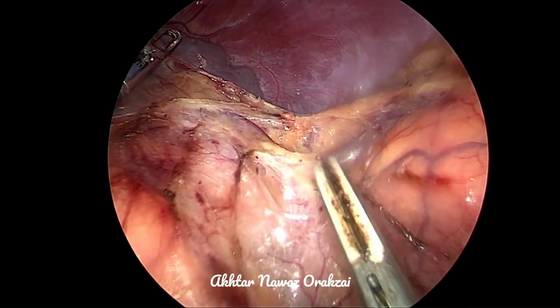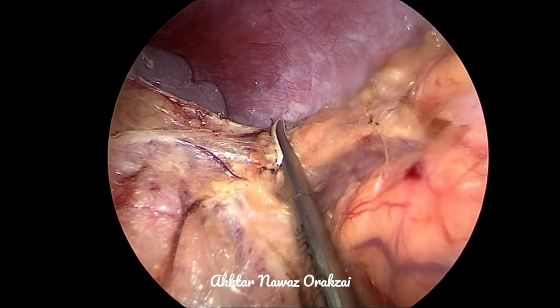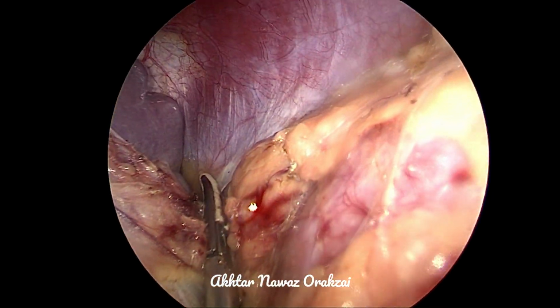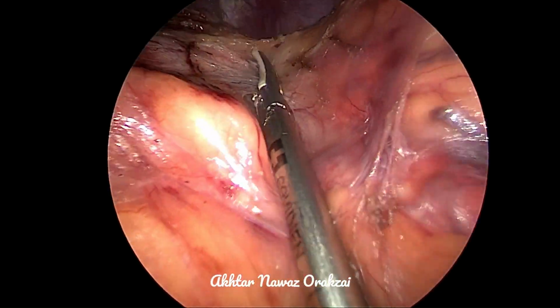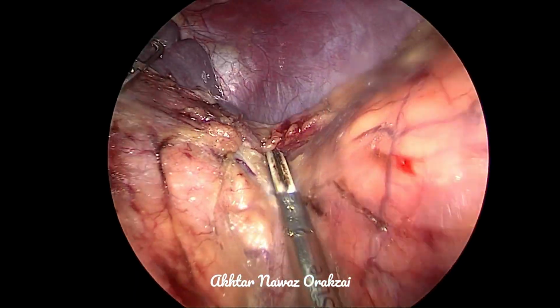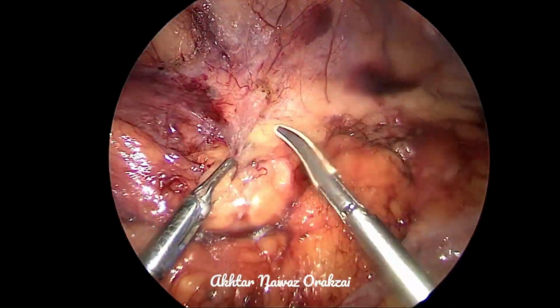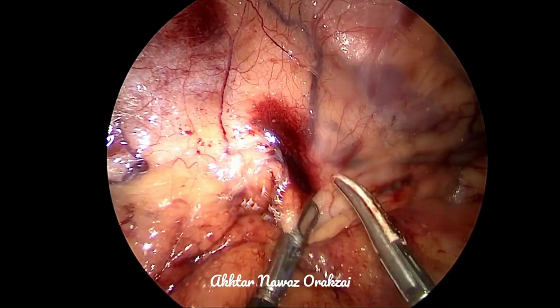The more we mobilize the spleen from the diaphragm, the easier it would be to dissect the adrenal gland. Care is being taken here not to go more towards the kidney and not towards the spleen, because that was the area where splenic vessels will be going.